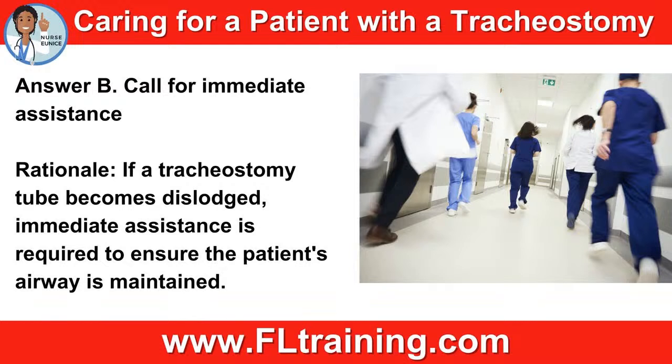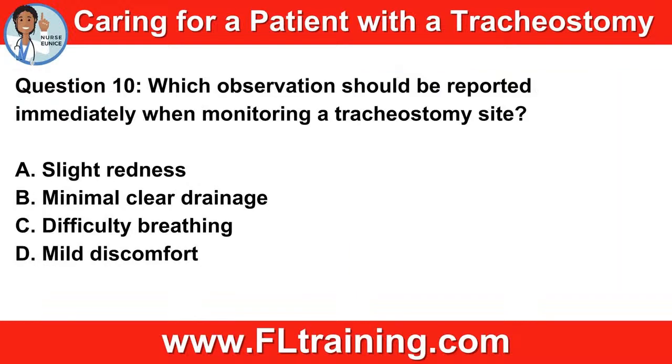So, if a tracheostomy tube becomes dislodged, immediate assistance is required to ensure the patient's airway is maintained. And remember, it's in their throat. And when it comes out, if they pull it out accidentally, it could be bloody. So, it could be a bit traumatizing, not just for you as the CNA, but also for that patient. So you get those nurses, the rest of that team in ASAP.